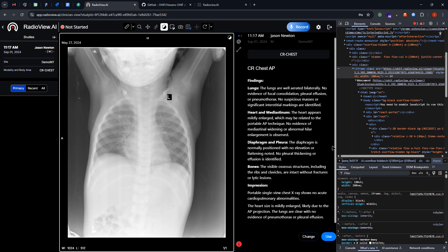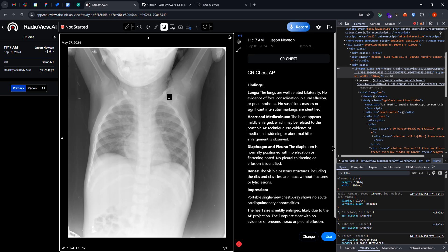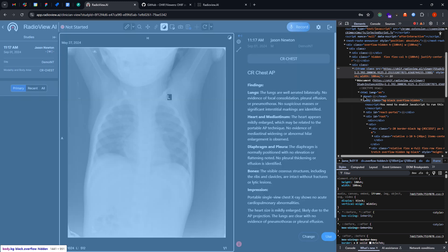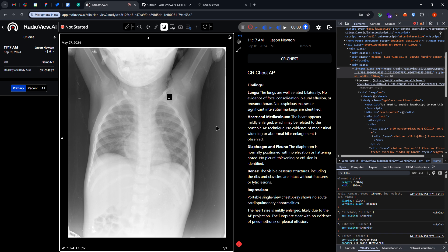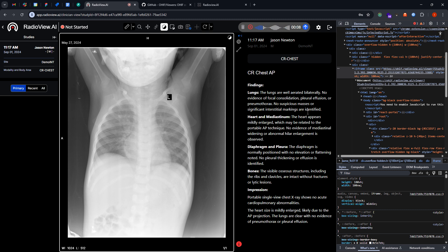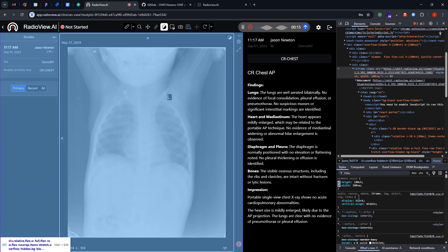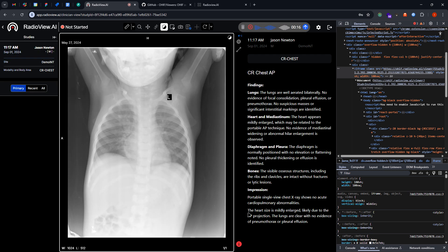It has the ambient options, like it has the ambient intelligence. When you click on use, let's say the findings: lungs are well aerated, bilaterally no evidence of focal consolidation. I'm not a radiologist, but this is how the radiologist will read out the findings from the images.